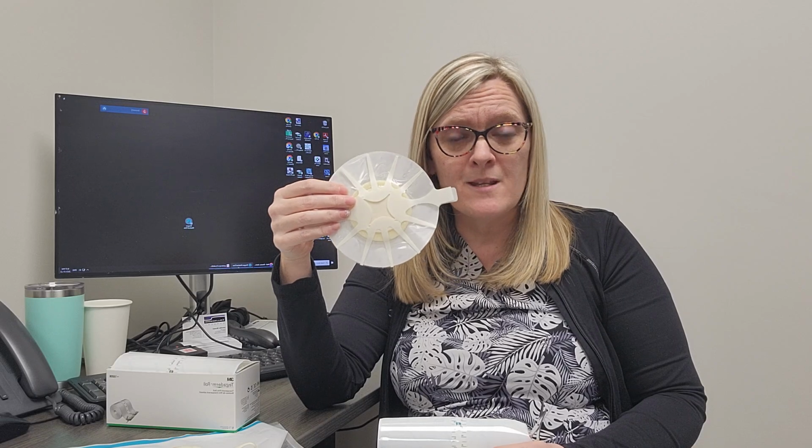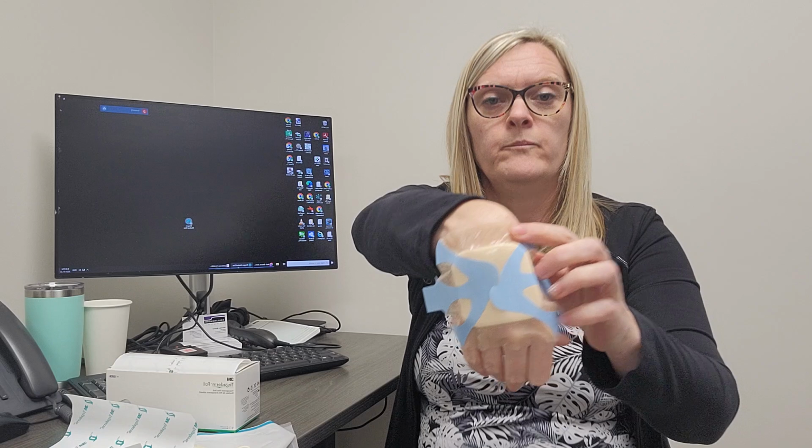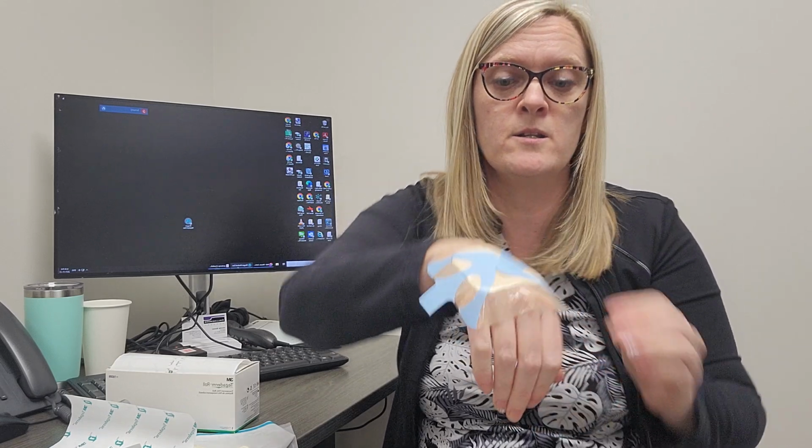Why is it so important to make this? Well, these dressings are fantastic to put on an elbow. Why? Because then the film all rolls up and you're able to get it conformed and get it sealed. These are actually waterproof. That's the other big piece. Silicone foams, yes, they tell us they're waterproof, but if there's any pucker in the silicone, and they do that quite easily, even if they're put on flat, we will get the edges when you go to put them on. See how they can pucker like this, and water can get into them, and then water fills up into this, and then it actually kind of renders our dressing useless.